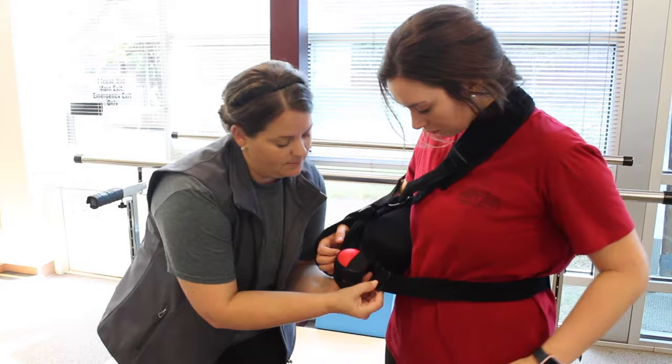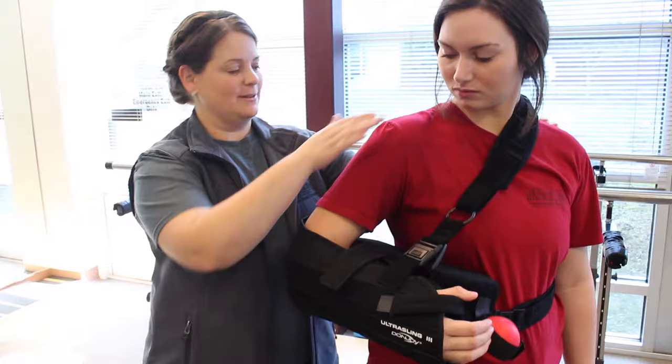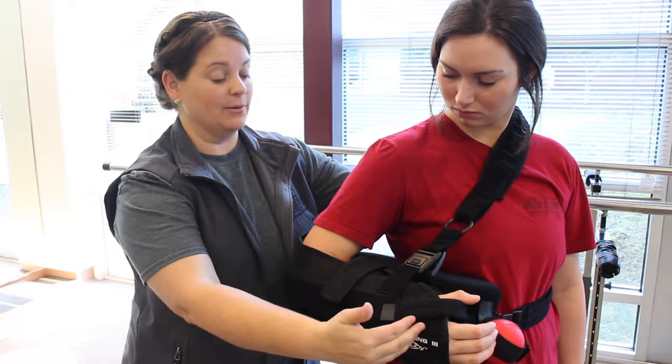Once both straps are in place, secure the forearm strap and the thumb strap. Check to ensure your shoulder is resting comfortably at your side with your elbow bent at a 90 degree angle.